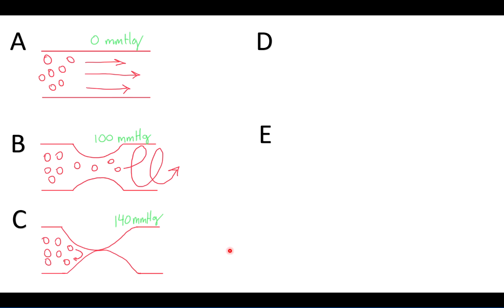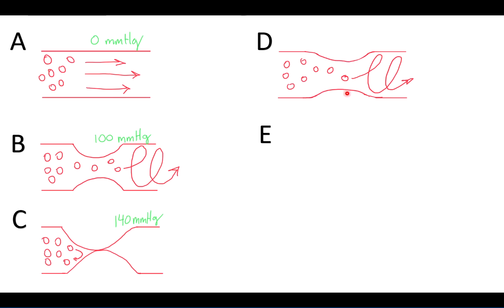So as we begin to release the cuff pressure at 2 to 3 millimeters of mercury per second, we'll slowly begin to open up this arterial vessel. And as we begin to open up the arterial vessel and the first red blood cell is able to sneak its way through, this is going to create the first Korotkoff sound.